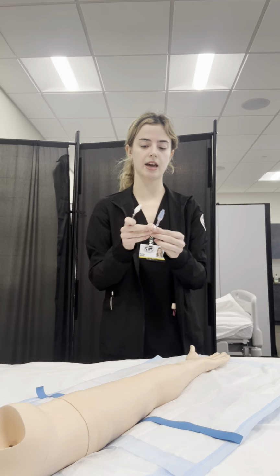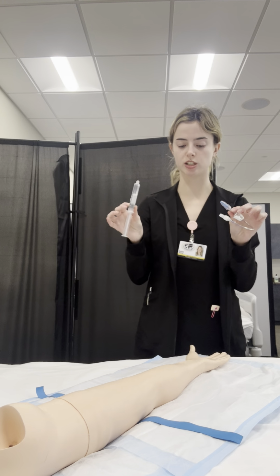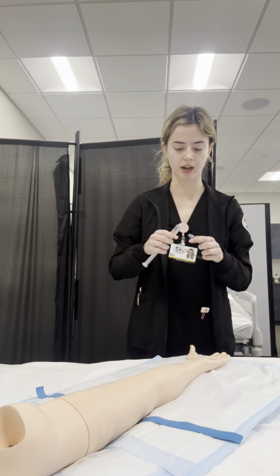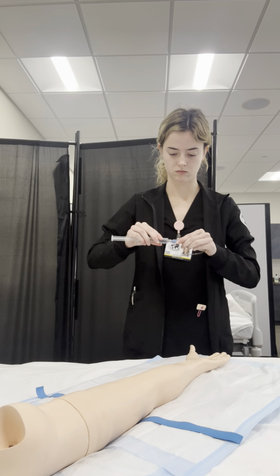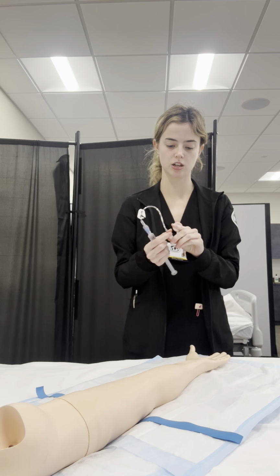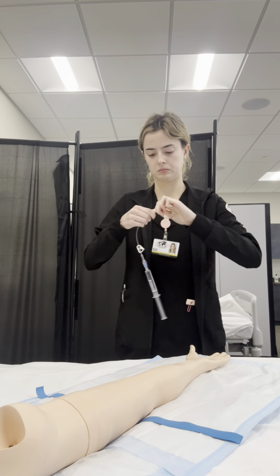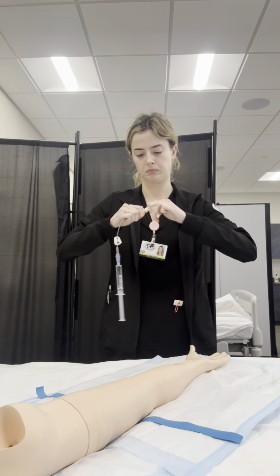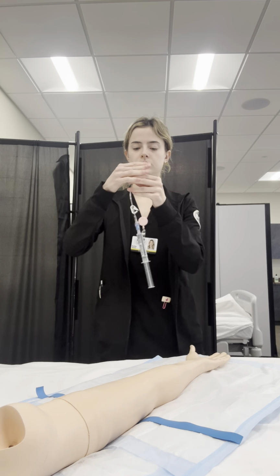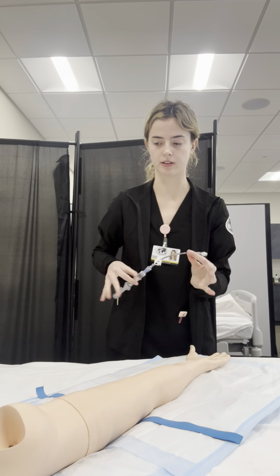I have my extension set. It is unclamped. So now what I want to do is go ahead and attach the normal saline to the extension set, so that way when I'm ready to attach it to the IV site, it's all ready to go. Okay, so that is attached. So I'm going to go ahead and remove this cap. And I want to make sure that this end doesn't touch anywhere that isn't clean.